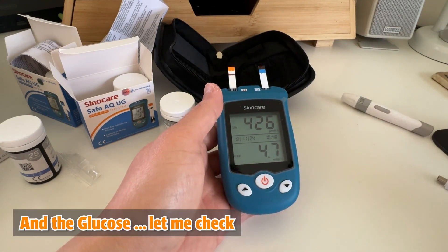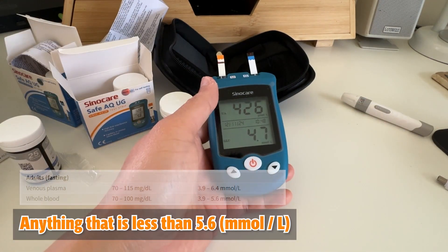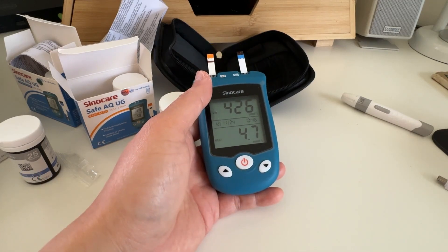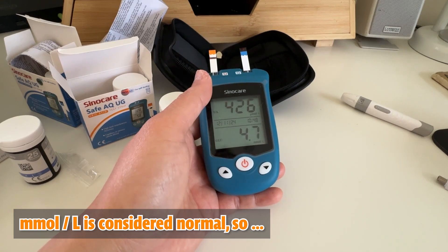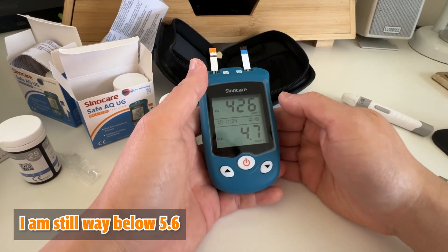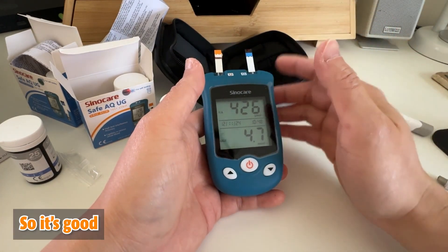And the glucose — anything less than 5.6 mmol per liter is considered normal, so I'm still way below 5.6. It's good.